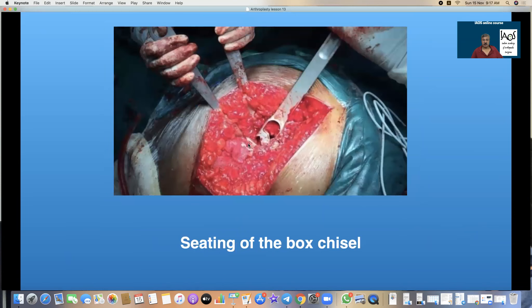You can see the lesser trochanter and the greater trochanter, and how far back into the greater trochanter the box chisel is being seated to ensure that we get a perfect entry into the femoral medulla.